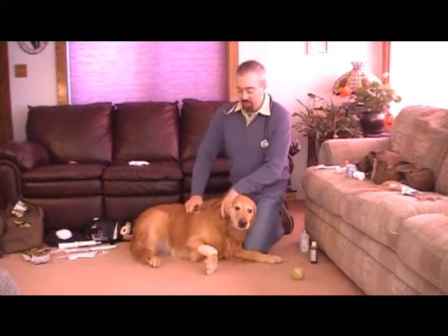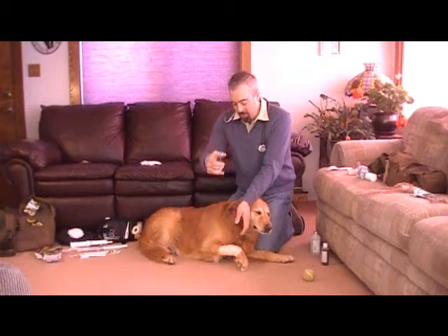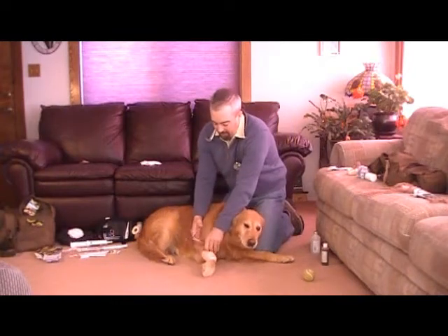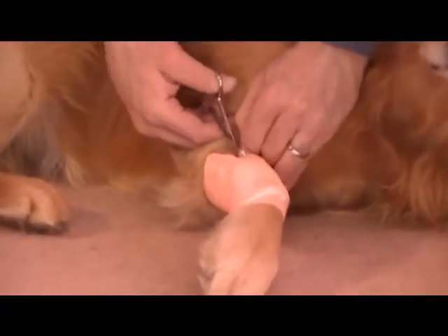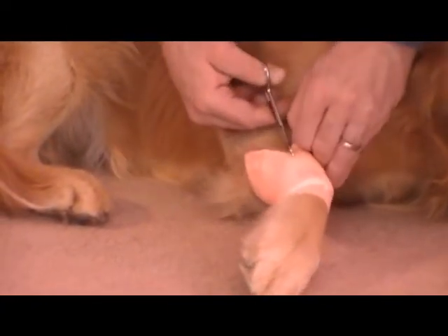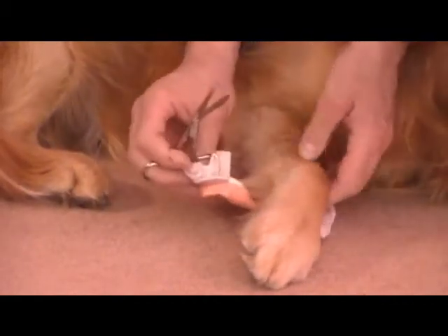The proper way to remove a bandage is to use bandage scissors, because they have a special bottom portion that prevents you from cutting into the skin. Simply put that bottom underneath and cut the bandage off — it's going to be really hard to undo what you did, especially after it's been on there for four or five days.